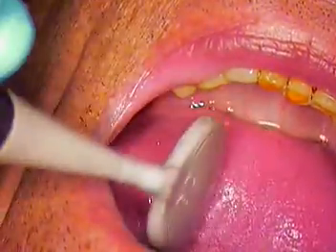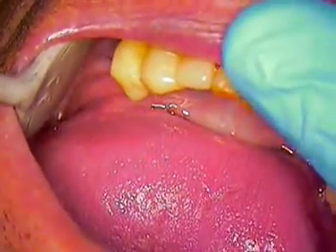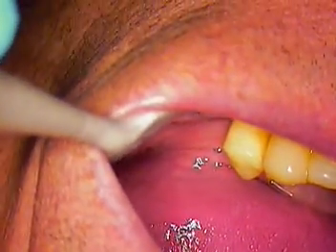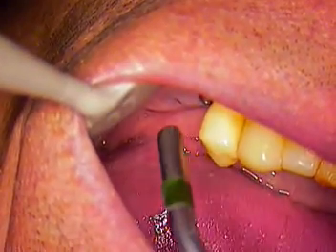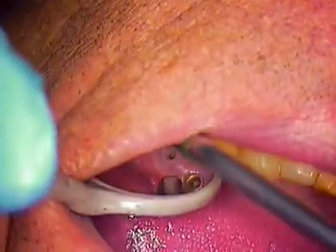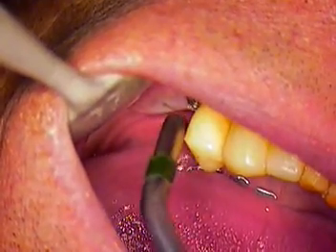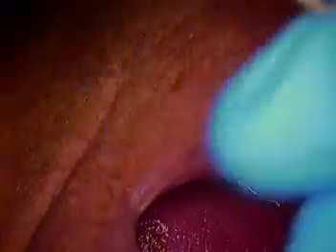We're going to go ahead and use our instruments. The first thing I'm going to use is just a blunt explorer. Larry, if you can go ahead and open for me, please. Alright, that's the bottom left, so we've got teeth numbers 19 and 20. Turn toward me, please. Now I'm just going to dry you off gently. You can see how the tissue is almost starting to close over on the one on the left, so I'll take a look at that one first.